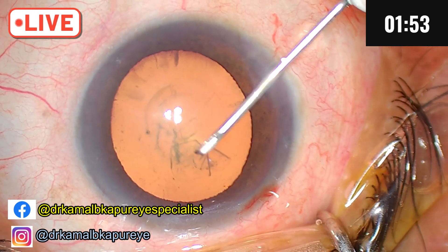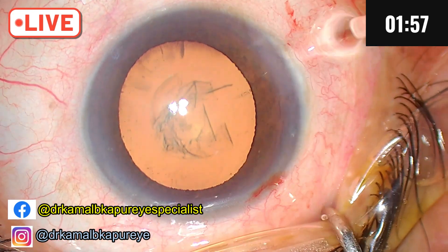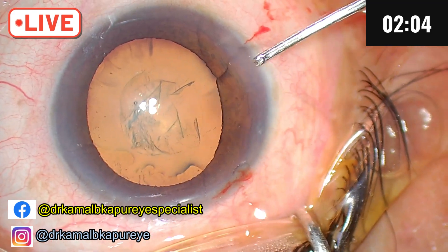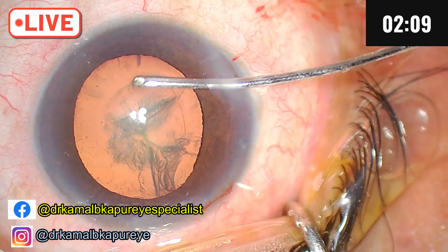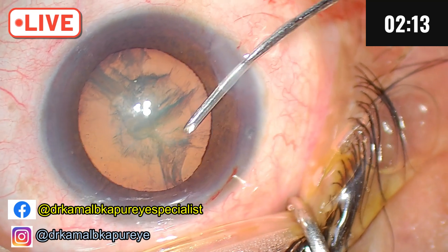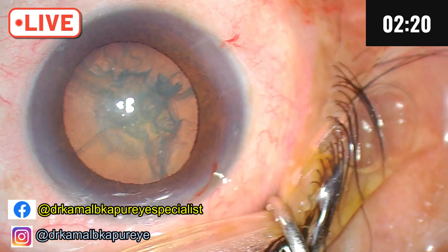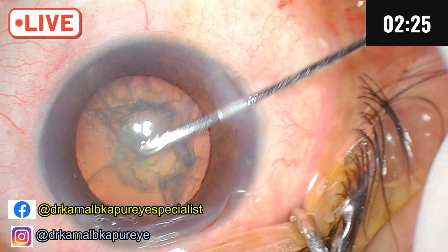I am going very slow because there is an increase in IOP of the patient, especially on dilatation. We did end up making a little smaller exit than we desired. Since the rhexis is small, it's going to be a tricky case because the chamber is shallowing again and again.